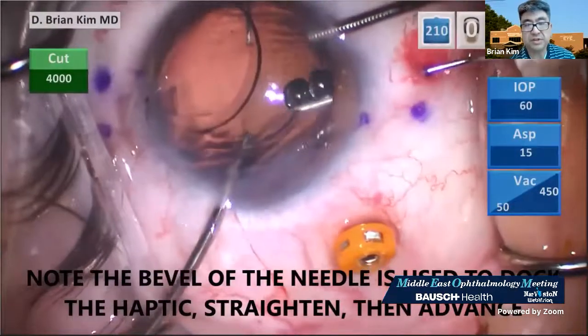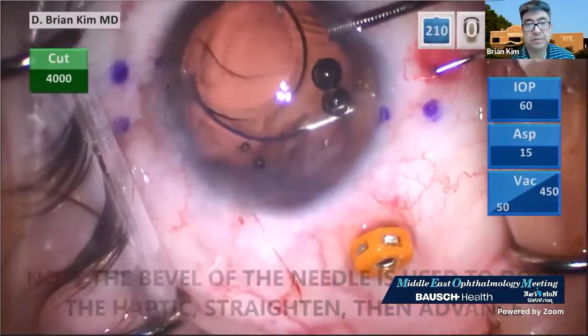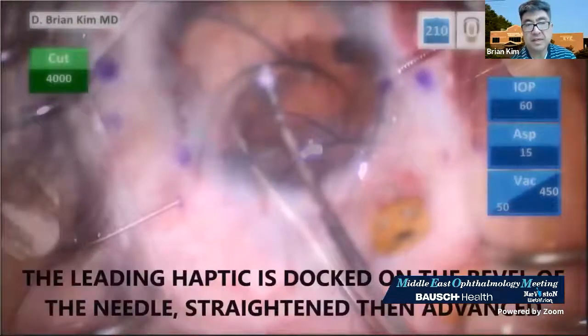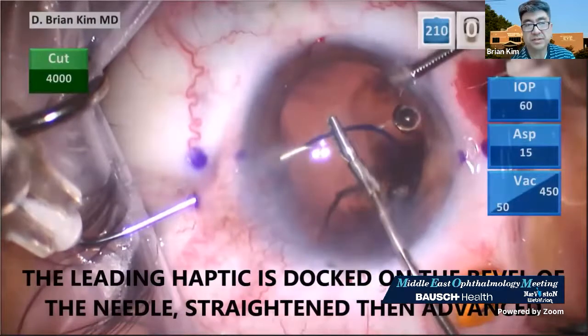Note the bevel of the needle is used to dock the haptic, then straighten, and then advance. The leading haptic is internalized with microforceps and placed into the angle. And then the leading haptic is docked on the bevel of the needle, straightened, and then advanced.